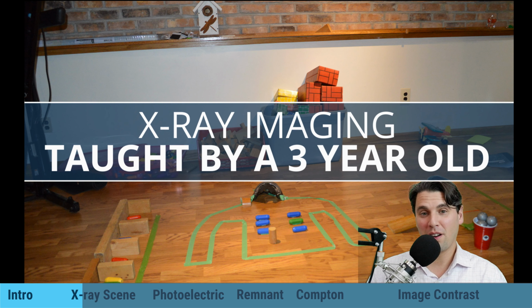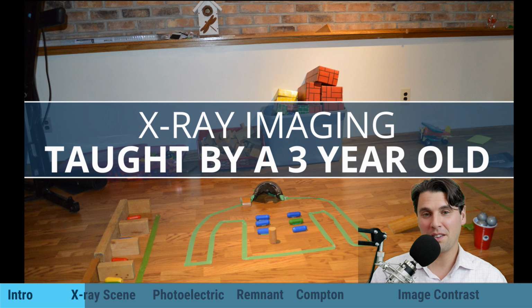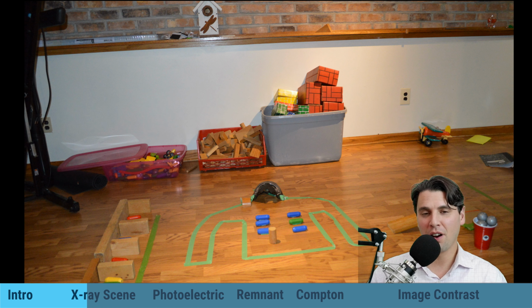So the first thing we're going to talk about is the scene, essentially. On the ground here in our basement, we've set up an outline. That tape outline is like the person. And then we're going to simulate X-rays going through that person by rolling balls. The little balls that we're going to roll through, those are the X-rays, our simulated X-rays.